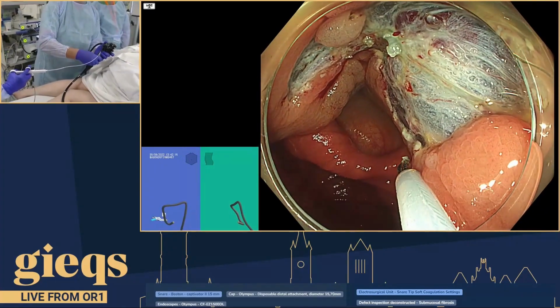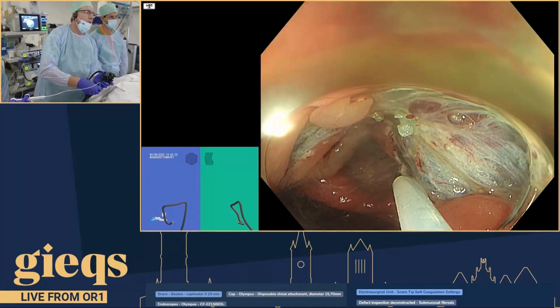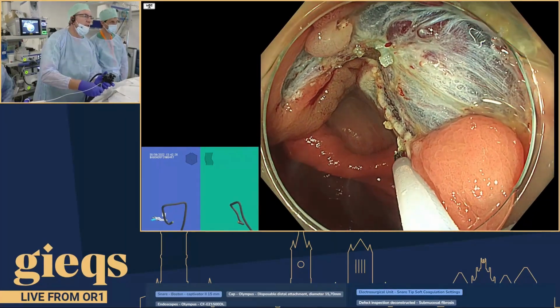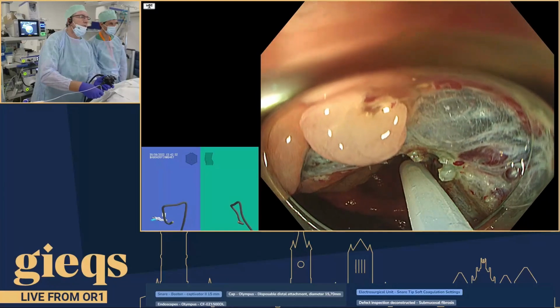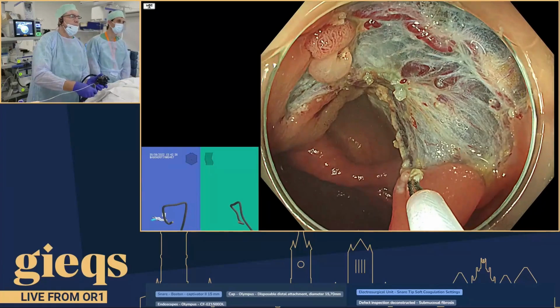I'll start here, and you want to work in a linear way. So I'm going to just go straight up here. And does it matter where you start, Mike? No, not really. But it's certainly easier to go in a straight line. Okay. So that side's all done, and then it's the same settings, but it's not the same effect.